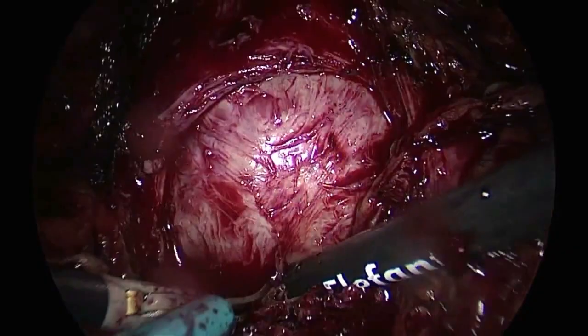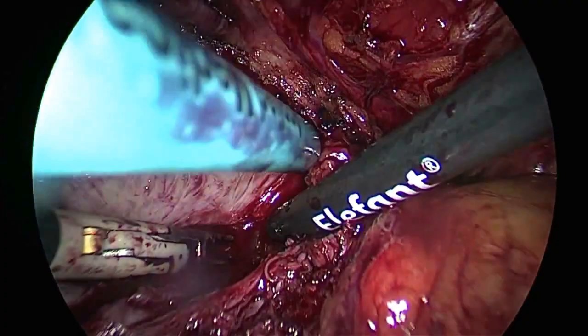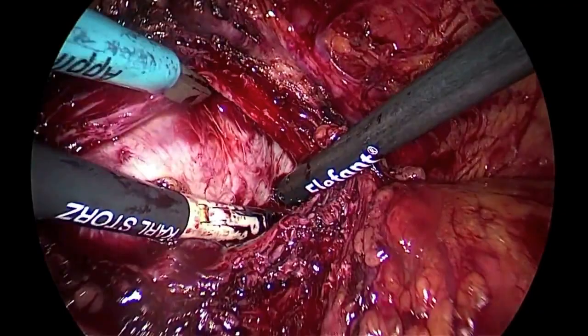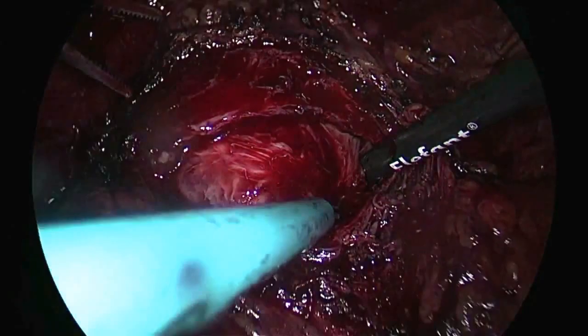Okay, in the right side. Can you raise a little bit the CO2 to 14? Is it possible to have 14? Okay, thank you. Coagulation, please.